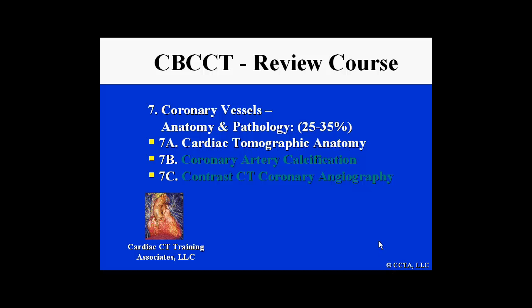This is Module 7, Coronary Vessels, Anatomy and Pathology, Module 7A, Cardiac Tomographic Anatomy.